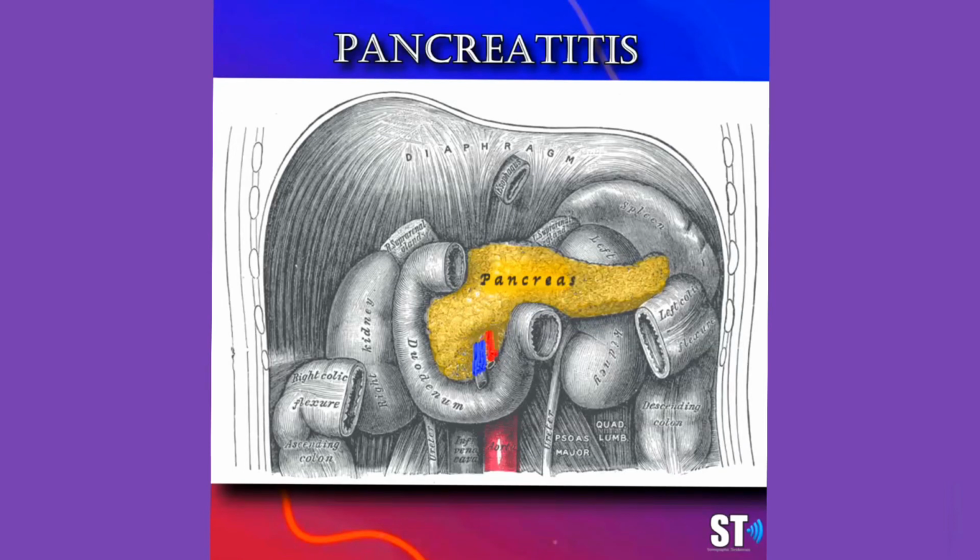All right, let's go over pancreatitis. Pancreatitis is inflammation of the pancreas, usually caused by things like alcoholism, gallstones, immune disease, hyperlipidemia, to name a few. If it is not completely obscured by gas and you're scanning a relatively thin patient where you can see it, well, you can go on.